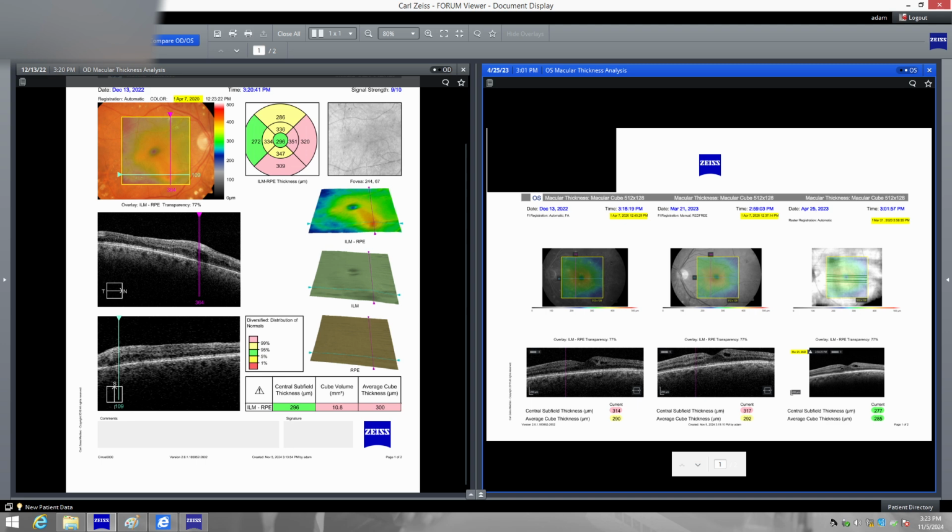A second one is basically, if you store it as DICOM, you will have it in your document display. Hence, you will have access on all the computers that do not have Retina or any other workplaces. You will see what the view was on that workplace using the document display. In that case, naturally, every time the patient comes, you'll have to get a new document.